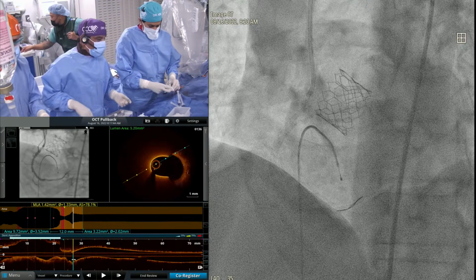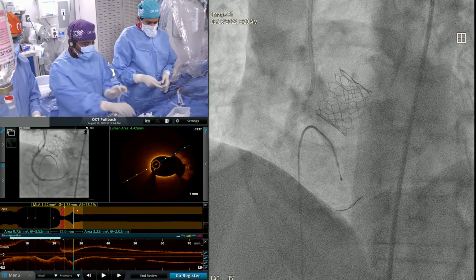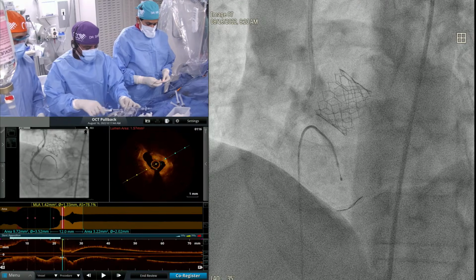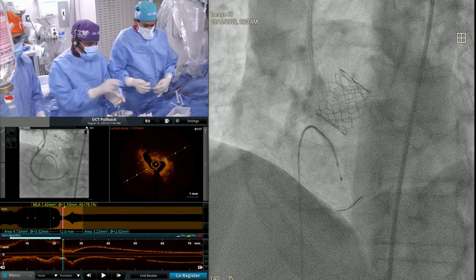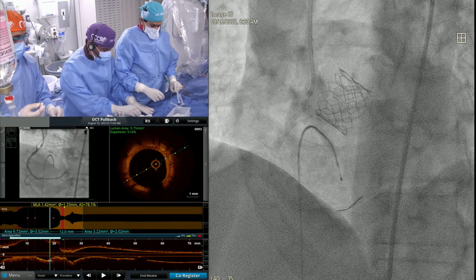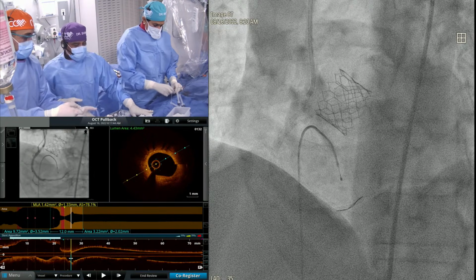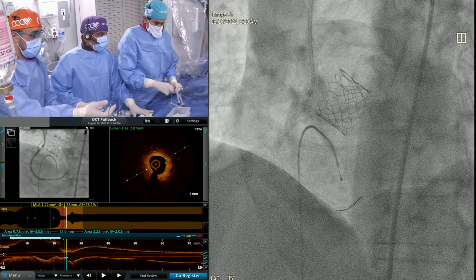So the question comes, within the stent, do you want to do it with saline or the dye? The key is that the whole concept of the laser in calcific and undilatable lesions is the explosion of vapor bubbles, and those explode if you do it with the dye. So in the native vessel there is more chance of dissection and perforation, but within the stent it's 45, 25.